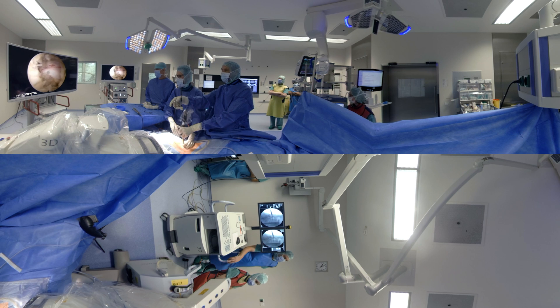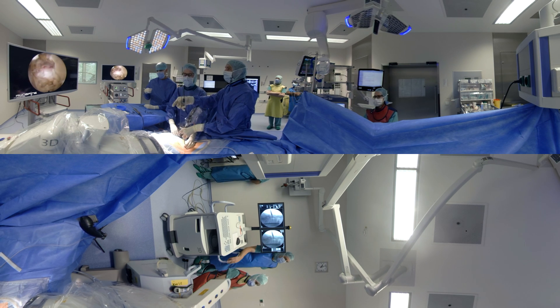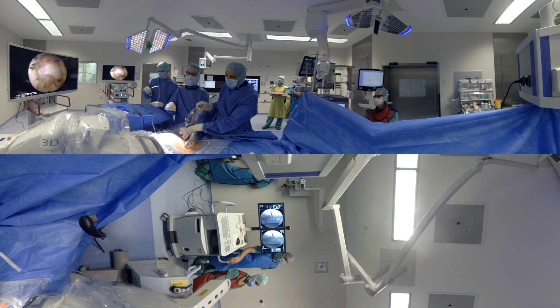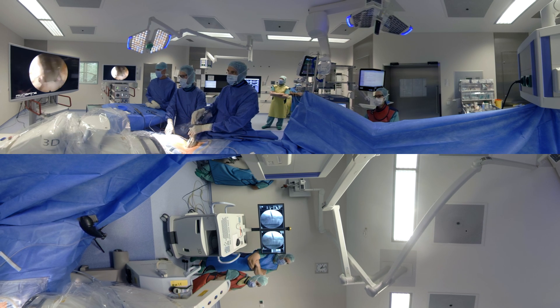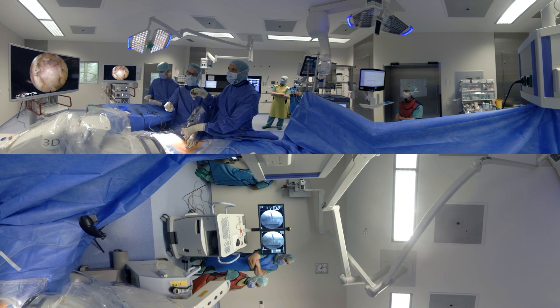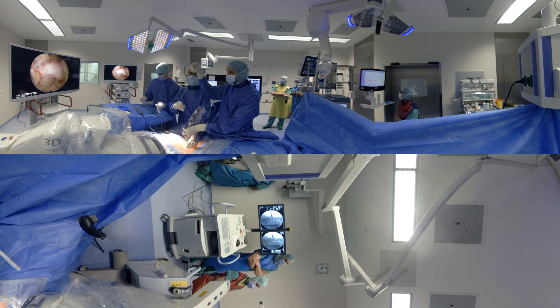Now we will mobilise. You can go through here with the bipolar already. I will perforate the posterior longitudinal ligament simply with a dissector. Be very careful — don't manipulate the neural structures too much. You go in now, you perforate the posterior longitudinal ligament, and there we can see the disc herniation coming out. We simply perforated the posterior longitudinal ligament and now we go in and will get out all these fragments that are causing his pain — under full visualisation so that it's safe. First fragment there — there will be more coming.